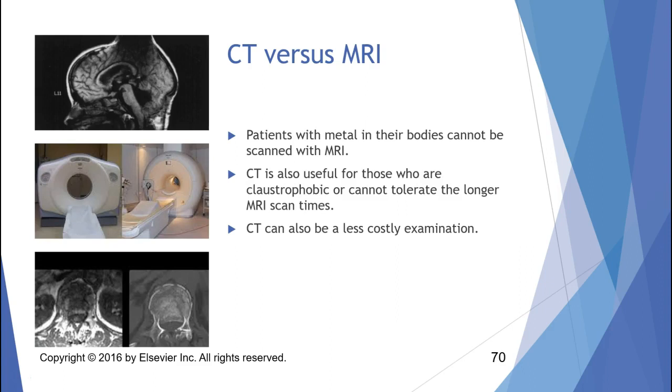About the shortest MRI scan that you're probably going to have out there in a diagnostic imaging facility is a half-hour time slot. That is because the patients need to be changed out. You don't want to take any patient clothing into MRI if you can avoid it, because people have stuff in their pockets that can be attracted to magnets, and it's very dangerous. You also need to screen them to make sure that they're safe, and these things all take time.